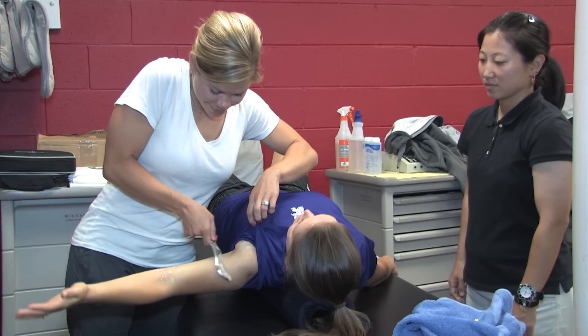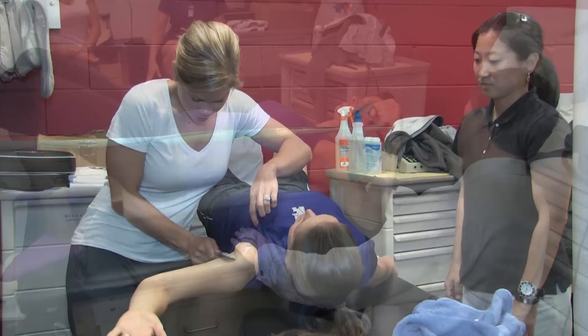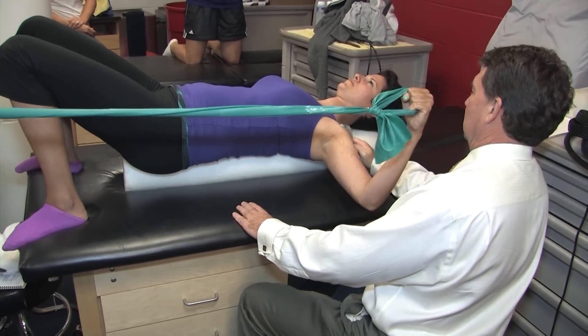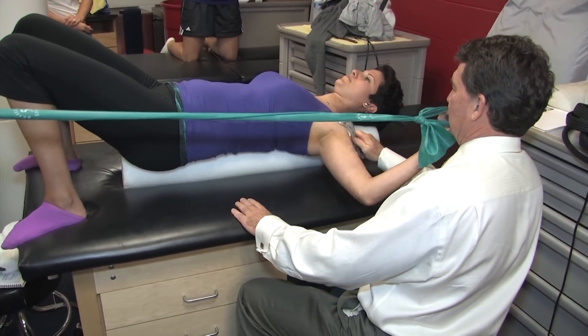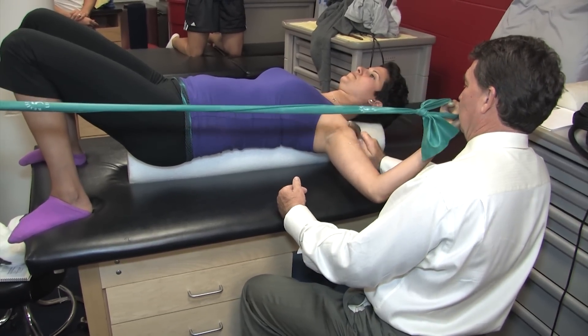They are using GARA and working the soft tissue restrictions. She is having her issue right on top. I can come through here — this nicely fits the top of her shoulder. But if this was too big I could easily turn and use the smaller diameter.